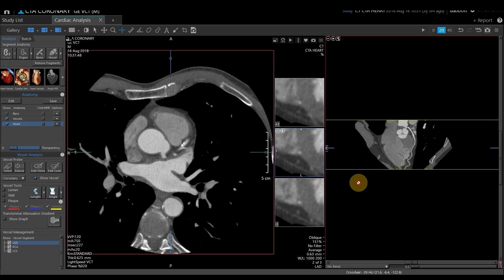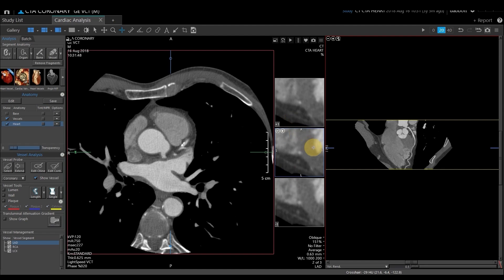I have my curved planar reformat on the right-hand side, my large axial dataset, and three smaller transaxial slices. Those transaxial slices correspond to where the blue hash on the curved planar intersects that specific vessel.